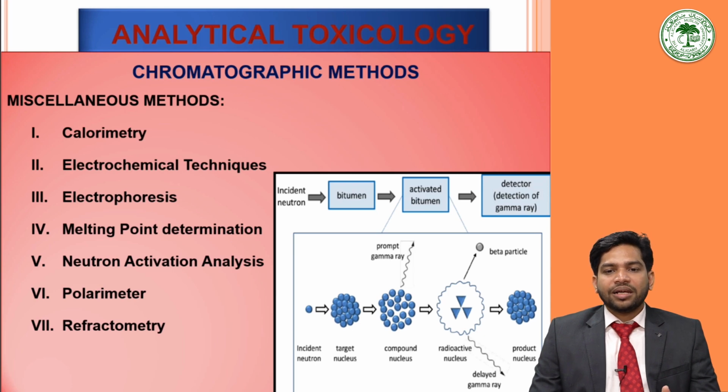Then similarly, in melting point determination, identification of the drug is done by its melting point, which is determined by the capillary tube. This melting point is then matched with the standard tables.